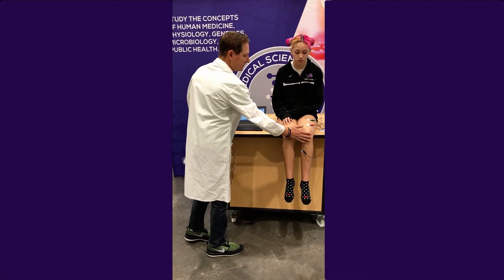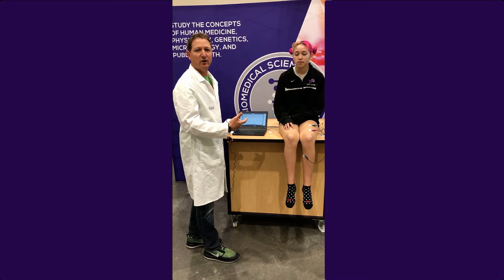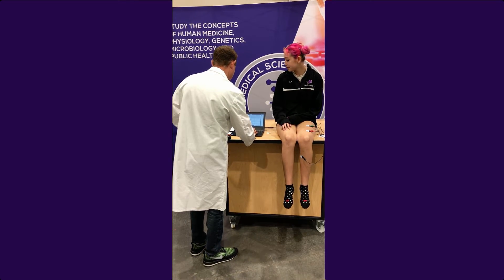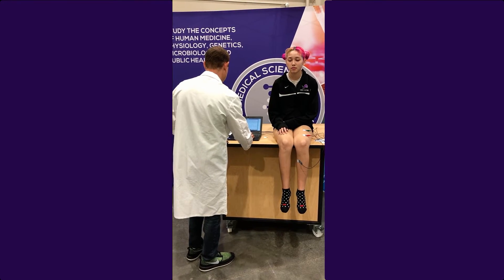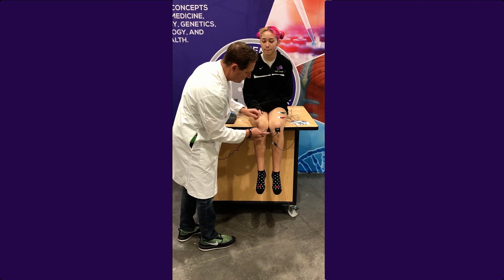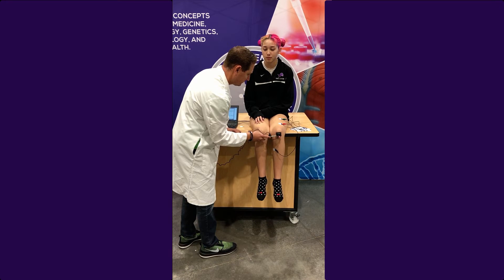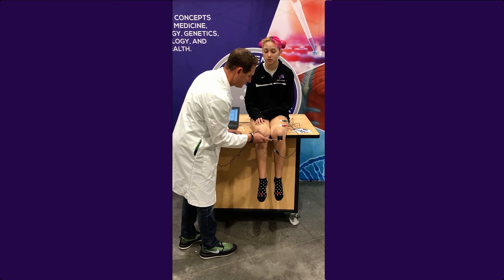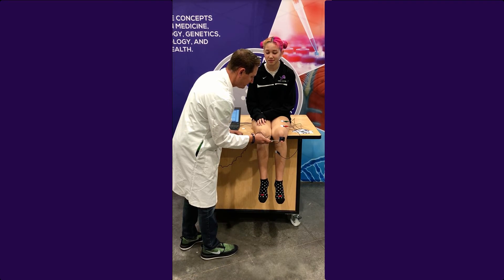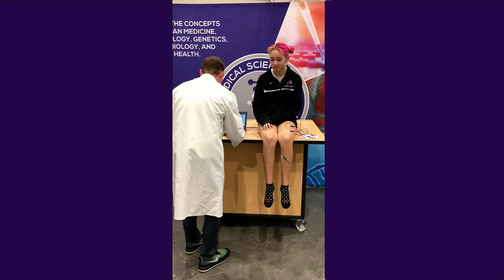My patient is all the way back so her legs are relaxed, and I'm going to have her close her eyes again. We're going to do five trials, but this time we're looking for a reflex instead of a voluntary action. I'm going to go ahead and hit collect. Go ahead and close your eyes. Find the patellar tendon. And I'm going to stop.